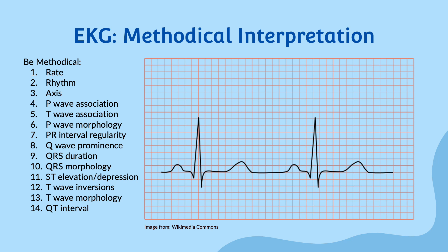We'll use the 300 rule to determine the rate here. So it looks like 300, 150, 100, 75 — so a little bit below 75 is going to be our rate.